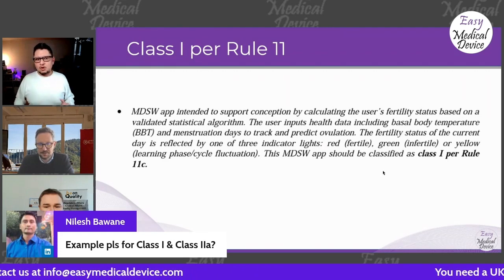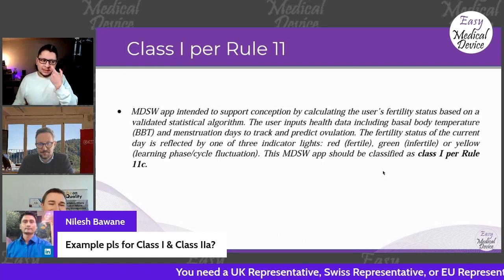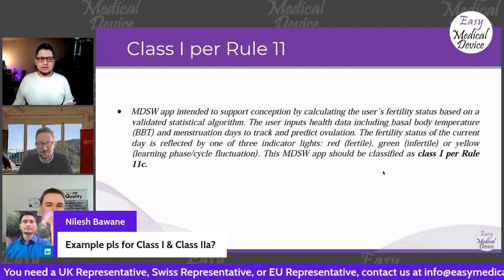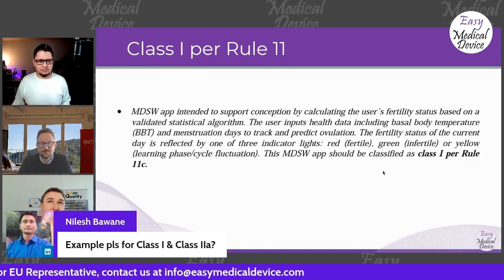So can we provide some other examples of maybe class 1? Maybe we talked also a bit about some of them, like the ones that are used for prognosis prediction. So is there some clear example of some class 1 devices that are really class 1 per Rule 11?